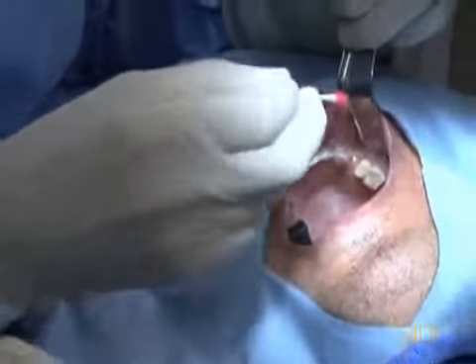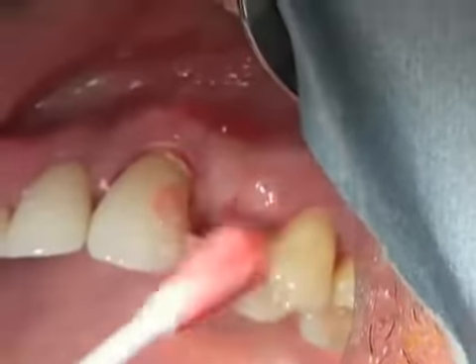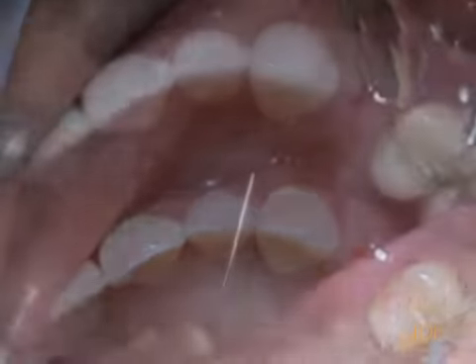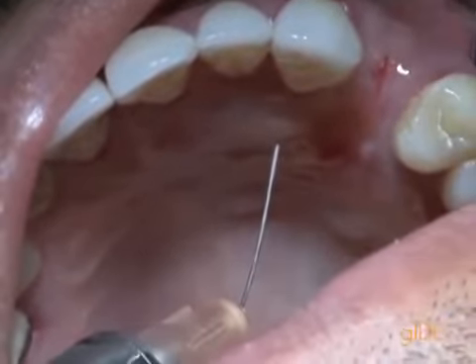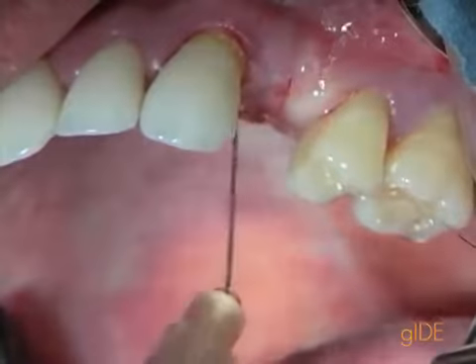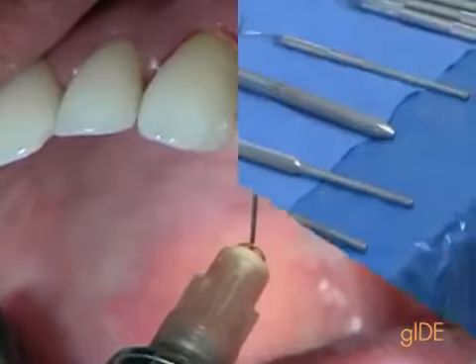Topical anesthetic is used for the surgical site, and local anesthetic can either be infiltration as used here or through block anesthetic. Here, local infiltration anesthetic is used in the palate, on the crestal and buccal.